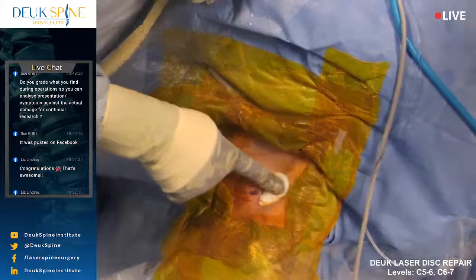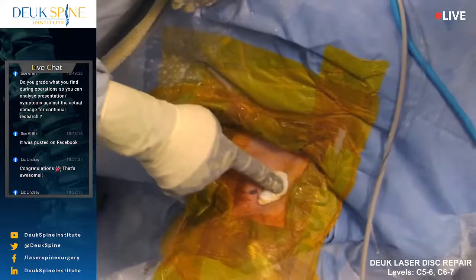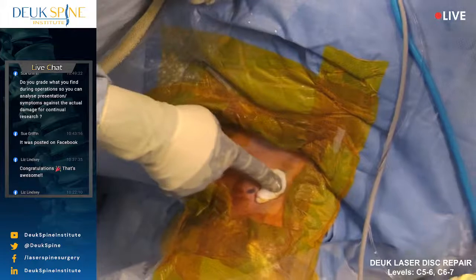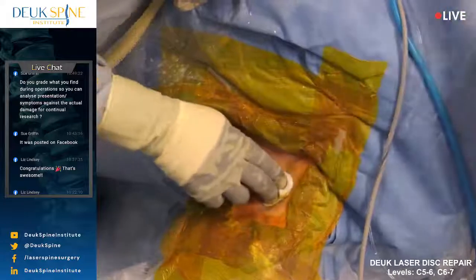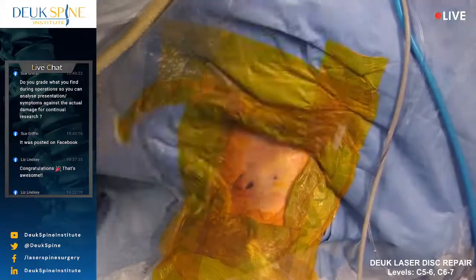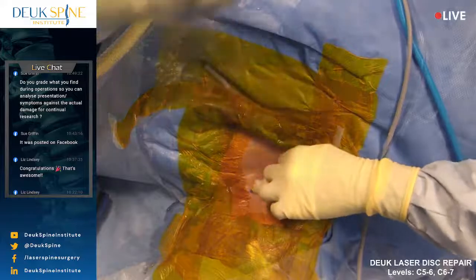And if you get a little bit of vein bleeding, you just put pressure and it stops. I don't know if we got a vein or not, but I just put pressure anyway. It's the safest thing to do. I don't want to have a blood clot forming. So that's it. I mean, the surgery's done. No metal, no fusion, no artificial disc, all natural. We repaired the disc. Take a look at the incision. That's it right there, 4 millimeters. The whole surgery was done through that incision. I'm going to have to call it, 0 blood loss, basically.